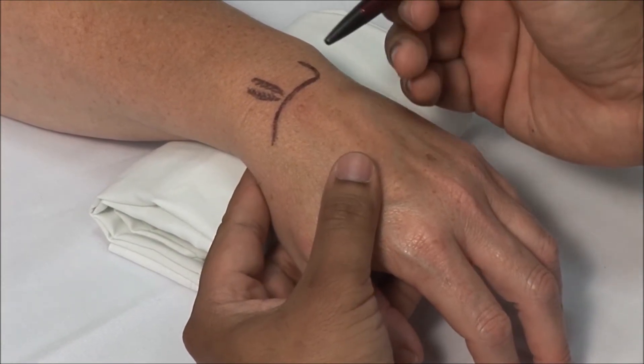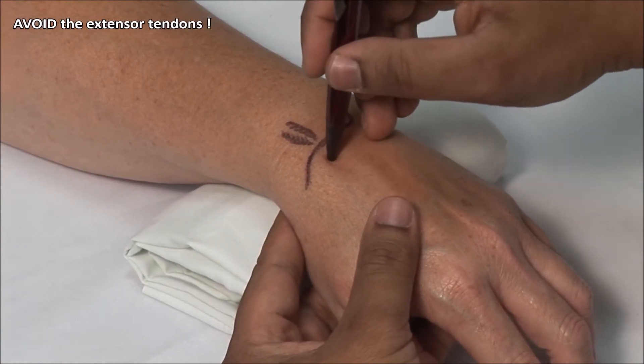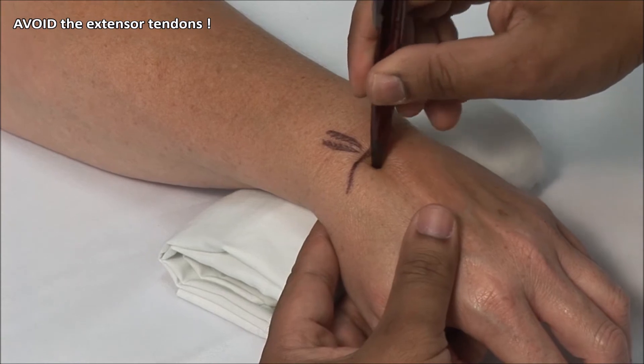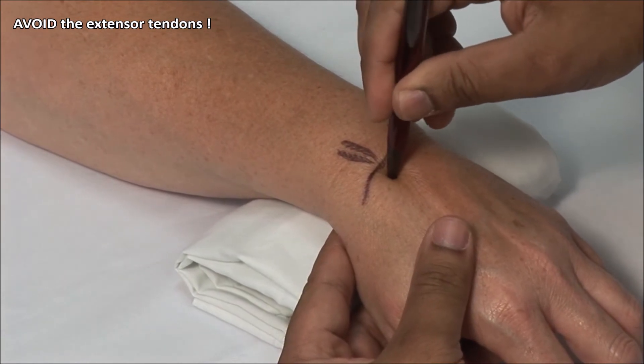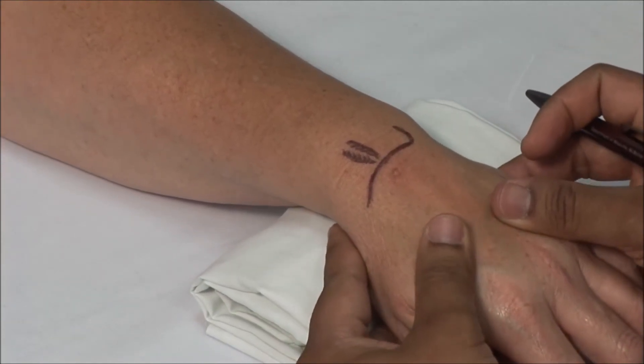Using a retractable pen, mark the point of injection. Be careful to avoid the extensor tendons. The injection is done with the forearm prone and the wrist slightly flexed.